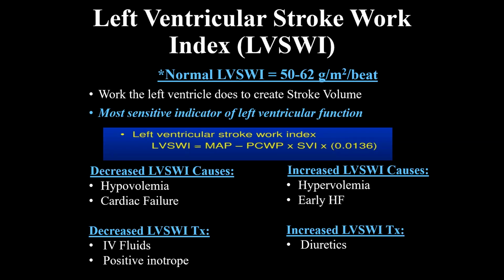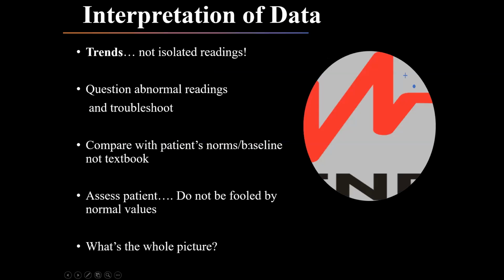Because if that baby isn't working, we're going to fail and we'll eventually go into right-sided heart failure and everything else. So it's really important that we know that number as well. It's a calculated number. It is not anything that we would see up on the monitor while you are taking care of the patient. You have to do some math. And guess what? The monitor does it for you. All right, so finally, and then we're done, guys.